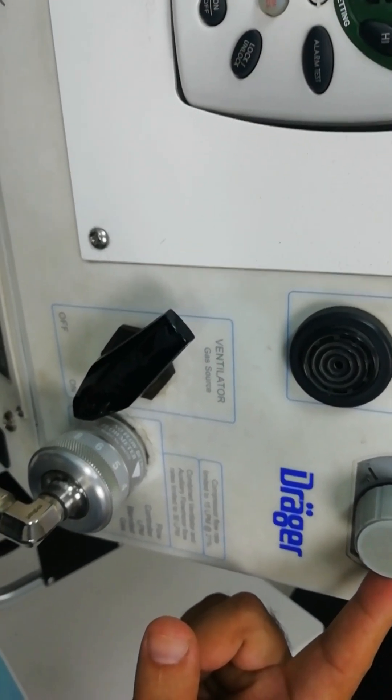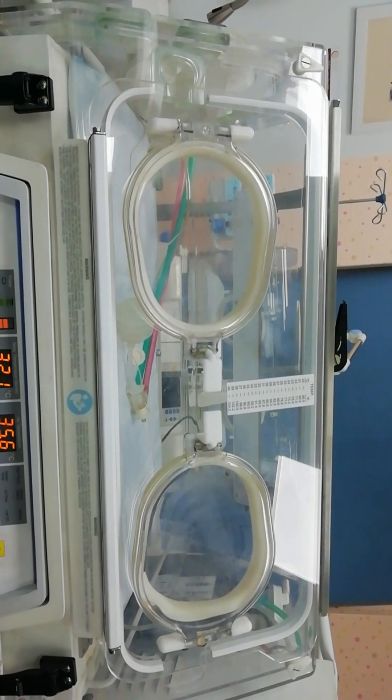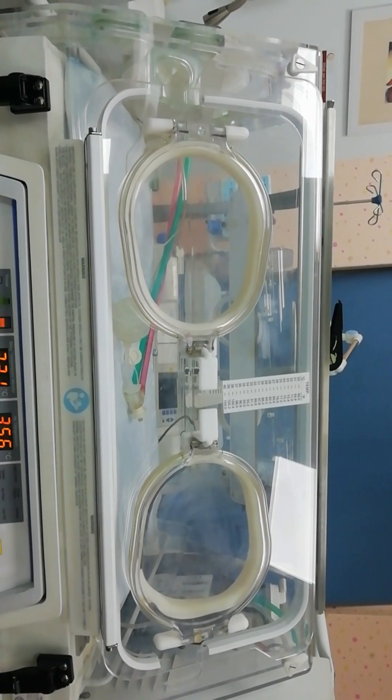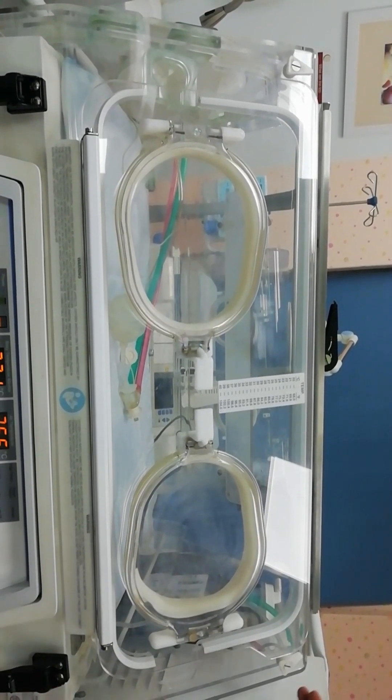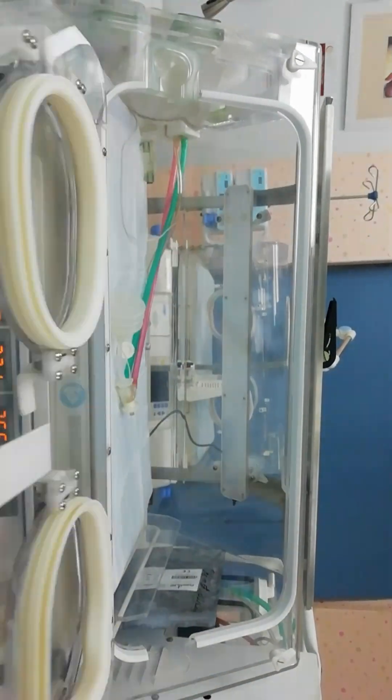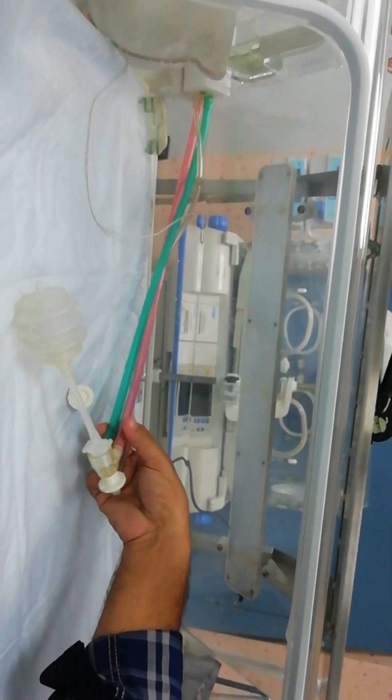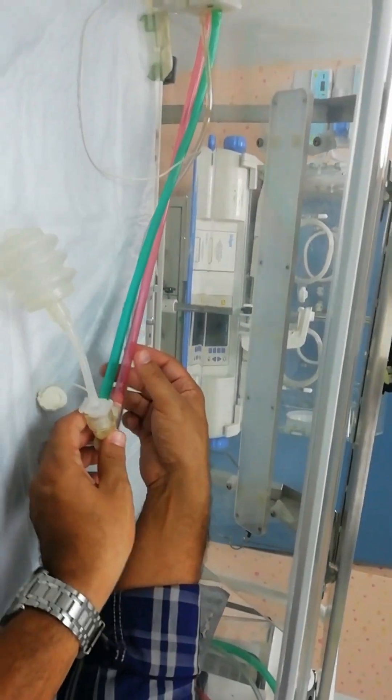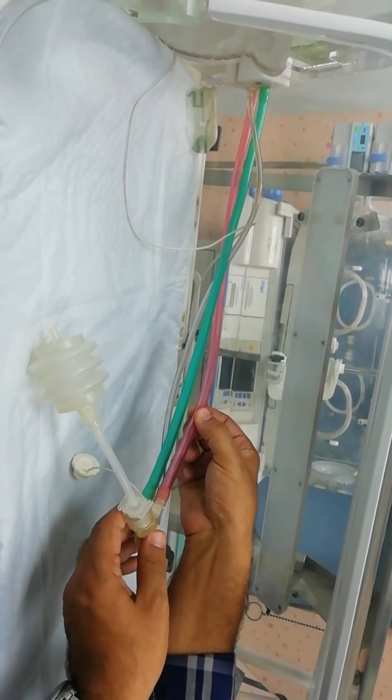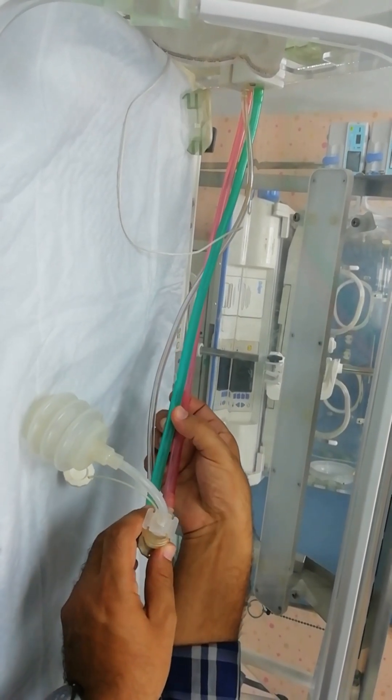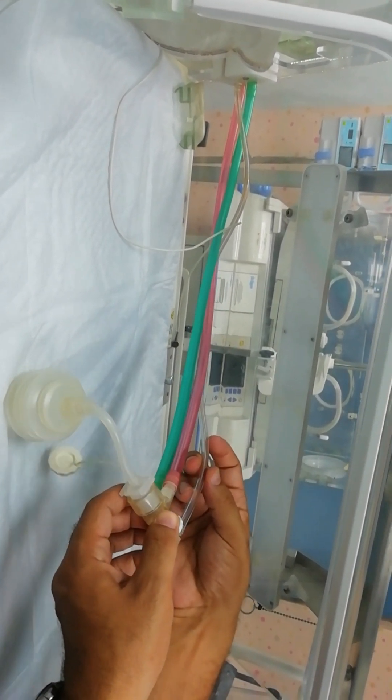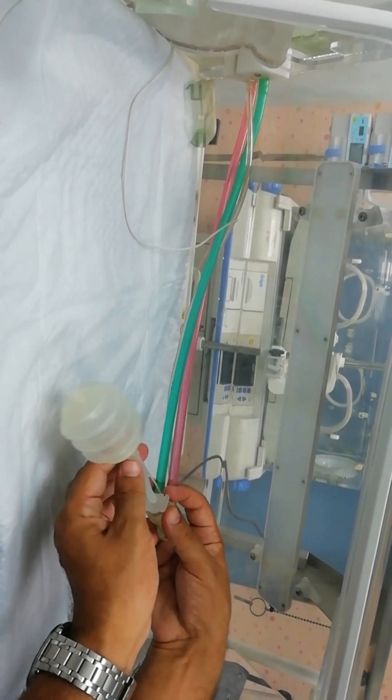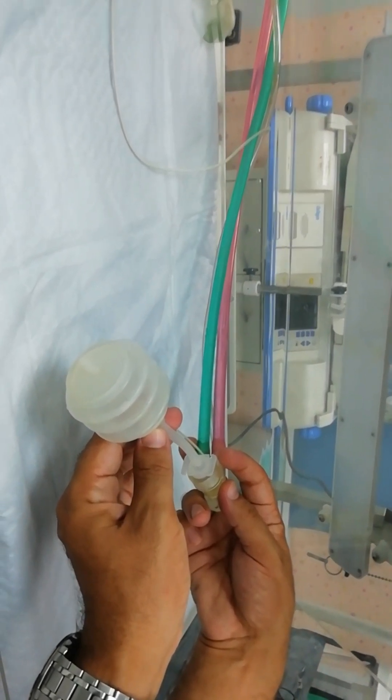After setting the transport temperature and the mechanical ventilation mode, we are going to check our circuit. So we have the red tubing that is used for the expiratory part and the green one for the inspiratory. And this part is for creating the pressure. And you can see the test lung is inflating.